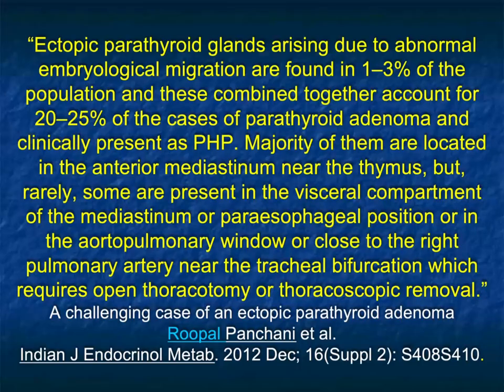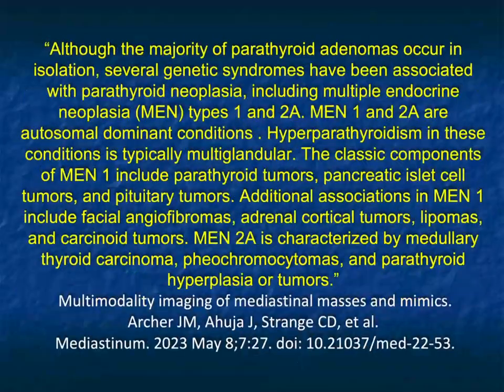Now again, this article by Rupal Panchani does make several good points. It's an older article, but talking about the majority in the anterior mediastinum near the thymus, but rarely can be other portions of the mediastinum. I have seen several just by the aortic arch, often to the left of midline. So it can be challenging unless you're thinking about it.